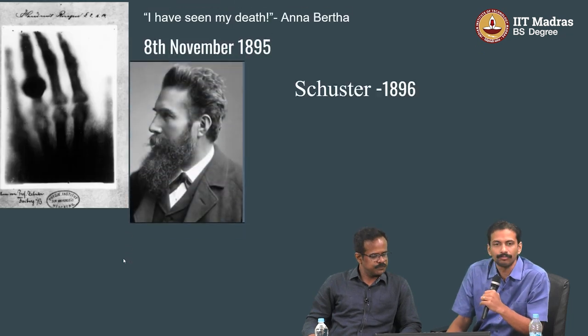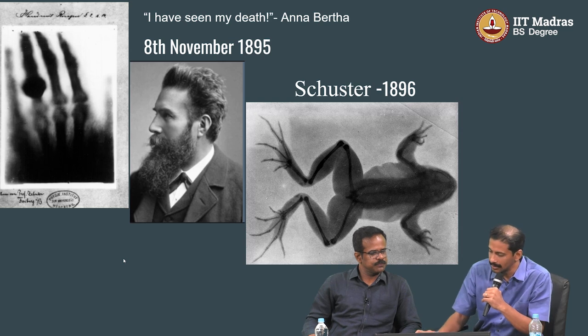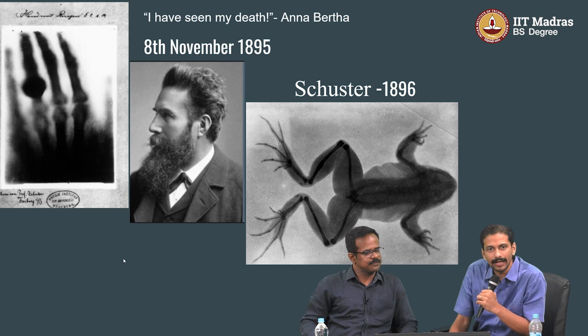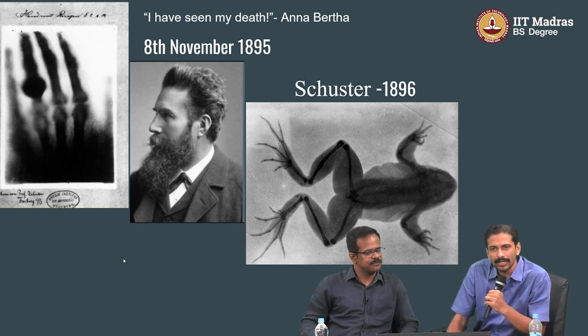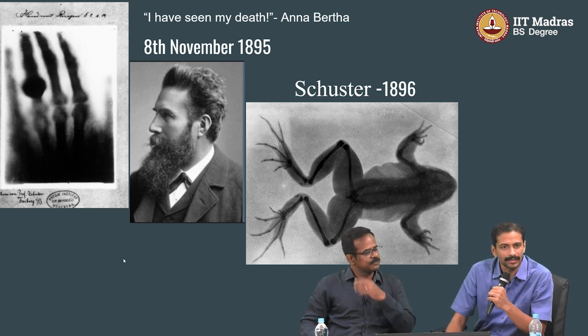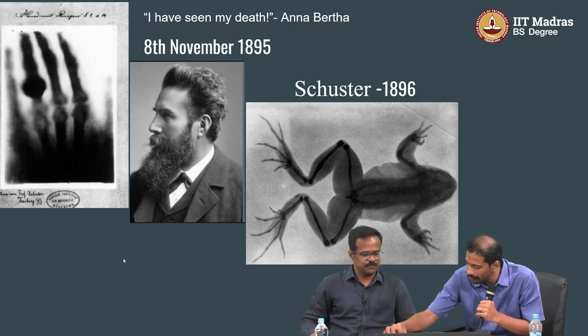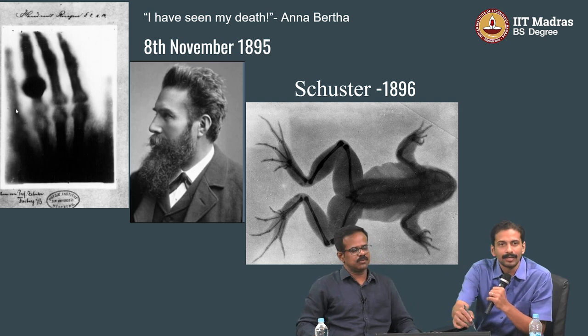the history of how X-ray was discovered. You all know X-ray was discovered in 1895, accidentally by Roentgen. He didn't know what those rays were, so he named them X-rays. And this was the first radiograph of... Can anyone guess what this radiograph is? Yeah.